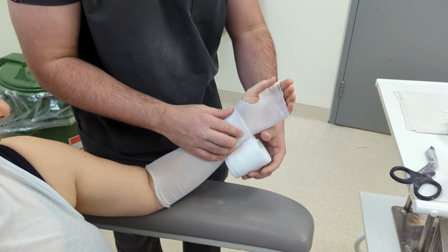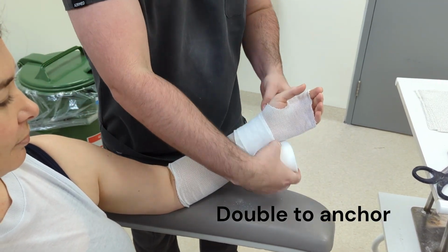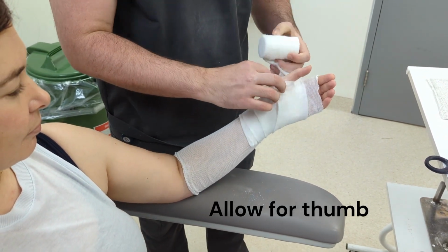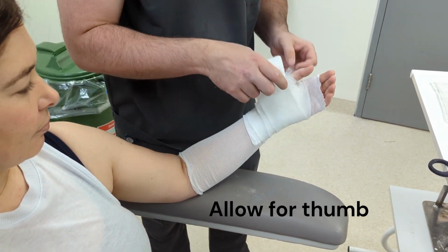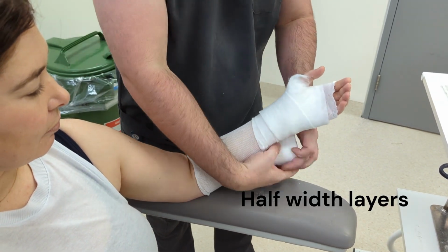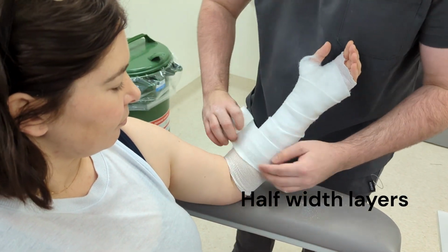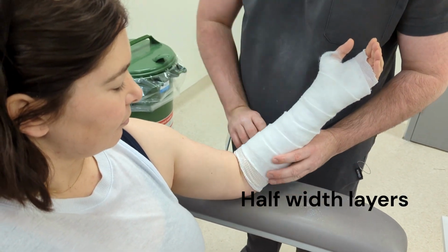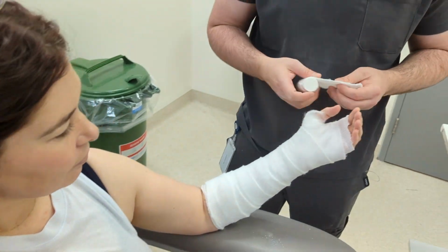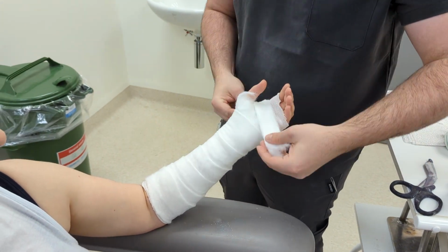Soft band is the first layer of the cast. It allows skin protection and cushioning. It's important to double wrap the first part for anchoring, and then allowing for the thumb. When continuing to wrap the rest of the forearm and wrist, it's important to overlap 1/2 of the width of the soft band. It is important also to ensure no skin is on show and the soft band is neat, tidy and tight. The ends of the soft band should be double layered to allow for fraying.